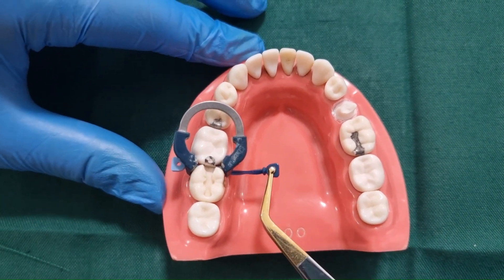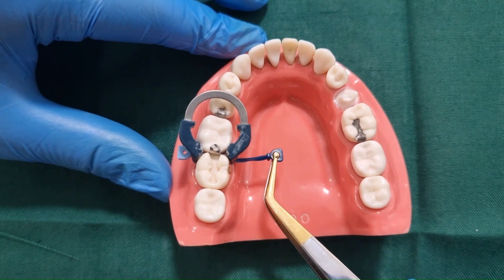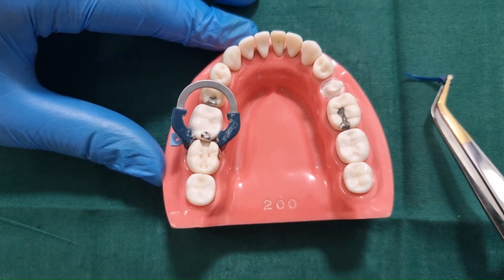Always make sure the golden color of the pin tweezer is on top.